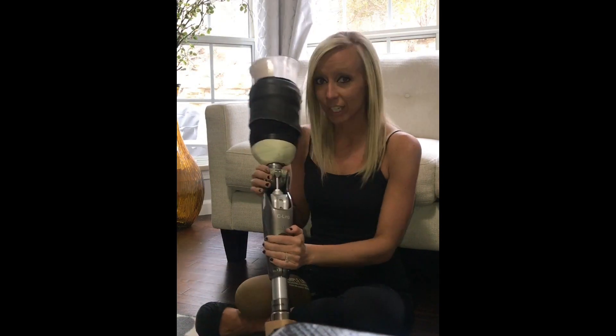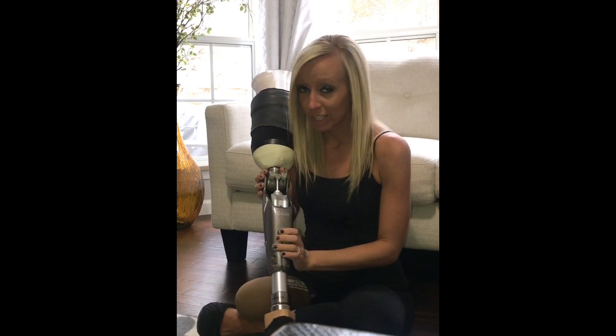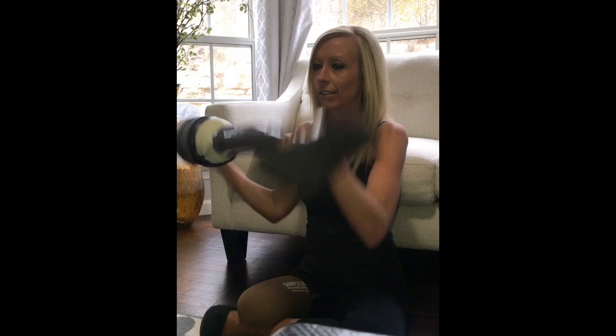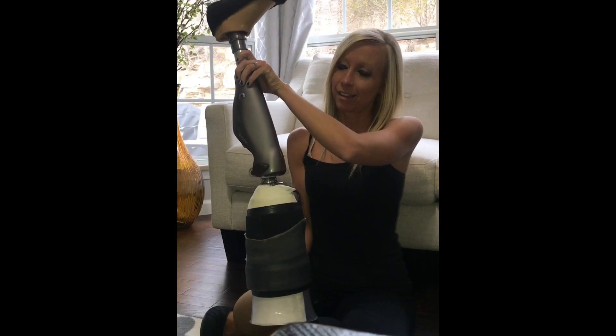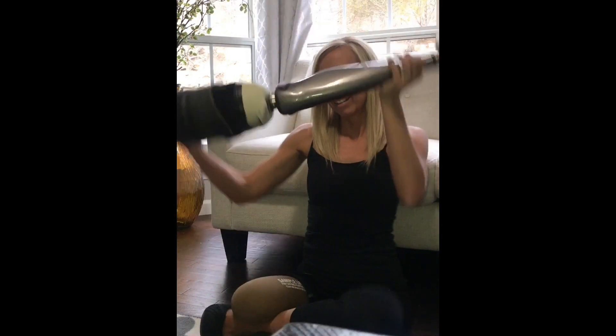If I forget to charge it — the little charging port is here — there's a cool way to check if it's charged. I'll show you now: just flip it and it beeps a bunch, so that's how I know if it's charged or not.